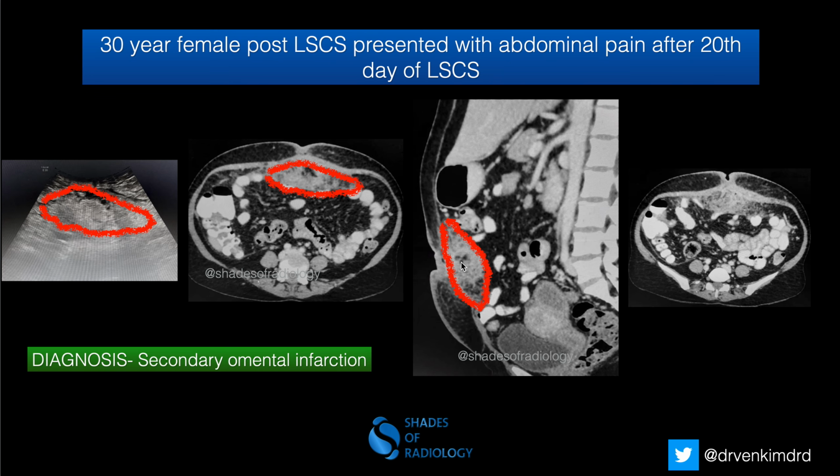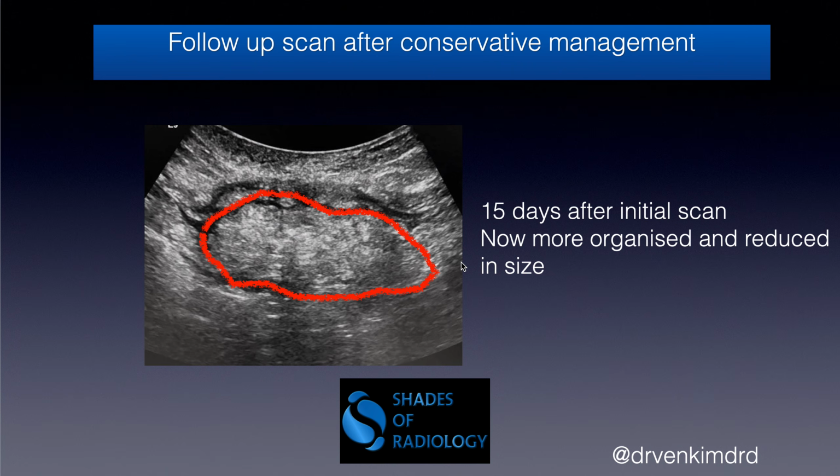Hence the diagnosis of secondary omental infarction was made, and on follow-up the ultrasound was done. The lesion is well formed and slightly reduced in size compared to the initial scan. So based on this and conservative management, we have come to the diagnosis of secondary omental infarction.